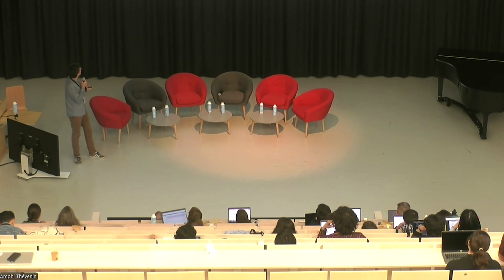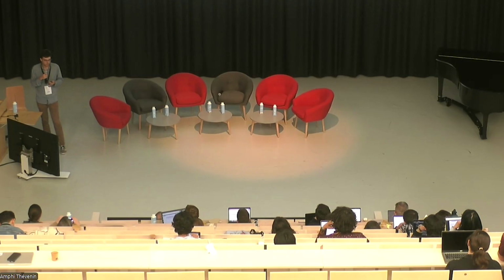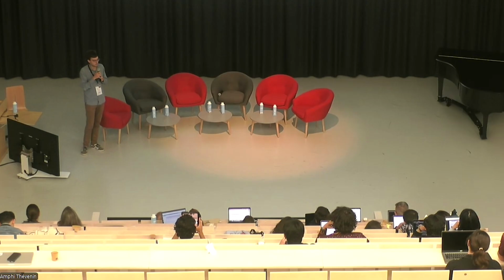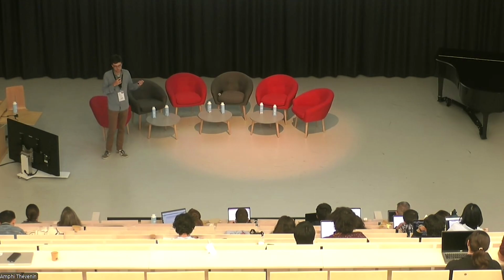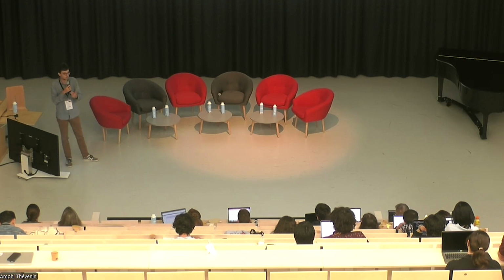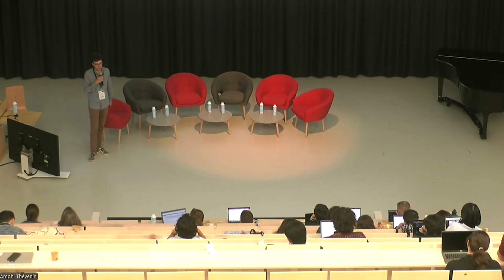And so then I will give you a bit of details about the current work that we are doing. In all the previous work on Curia, we used only the image. We never used any textual representations or any labels, but we actually have access to a very big source of labels, which are the radiology reports, because all studies that are done in radiology are associated with a report, which is quite long. It can be like 1 page of description of the image, organ by organ. So it's a huge source of information.